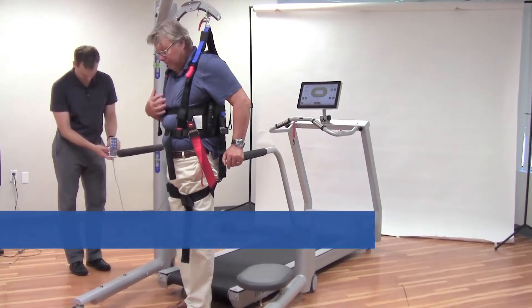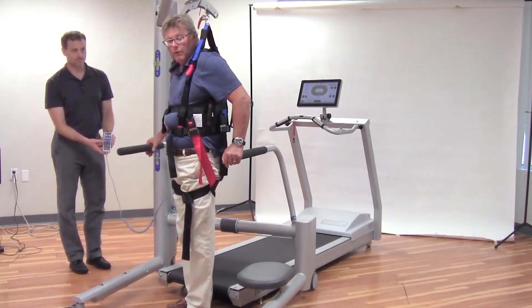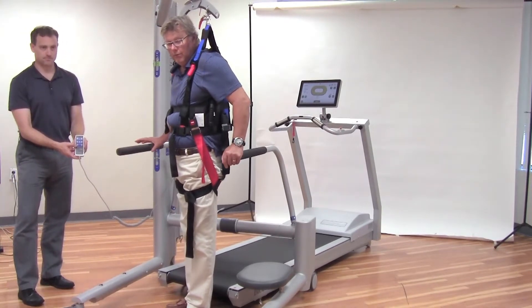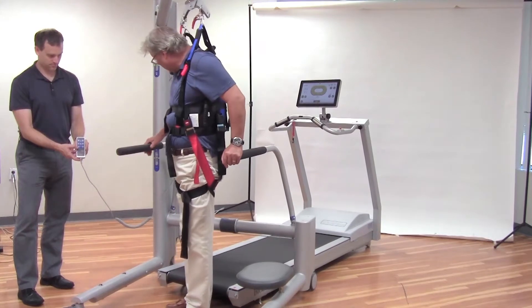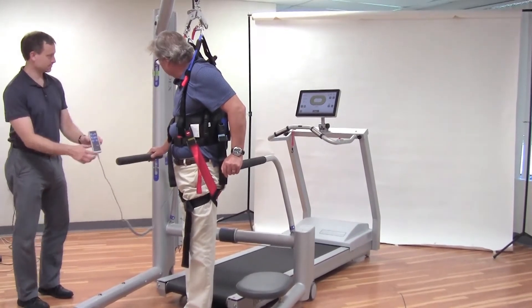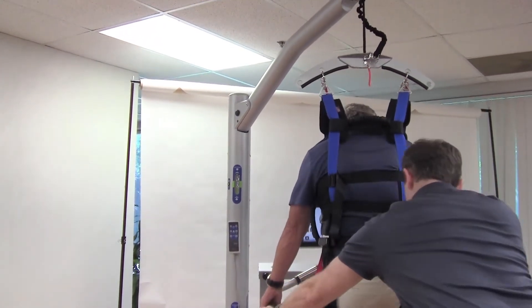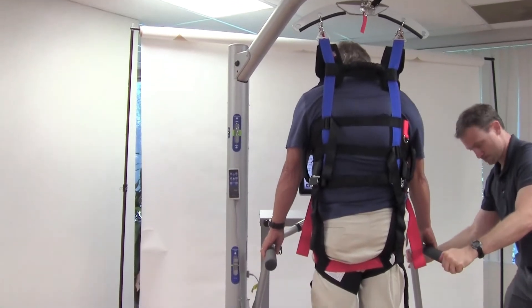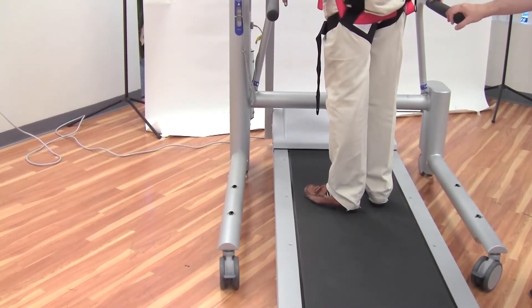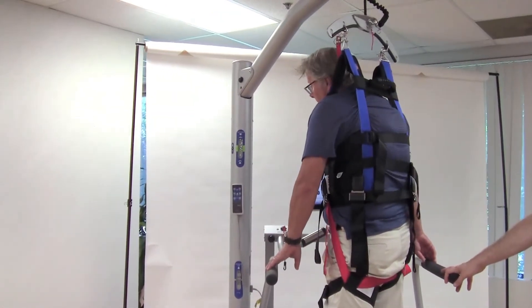When you have the patient in the vest and want to get them on the treadmill, the auto-load feature is a nice way to apply the desired load without readjusting things. With 50 pounds set and the bar height in the middle, we select auto load. As you can see, once I stepped up on the treadmill, that six inches of raised elevation was automatically compensated for with the auto load.